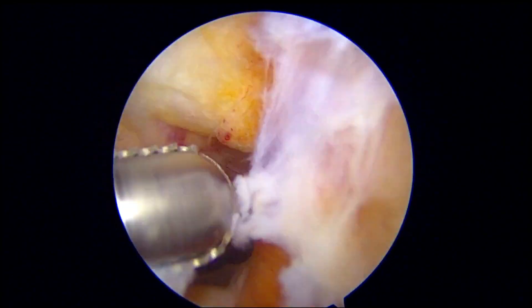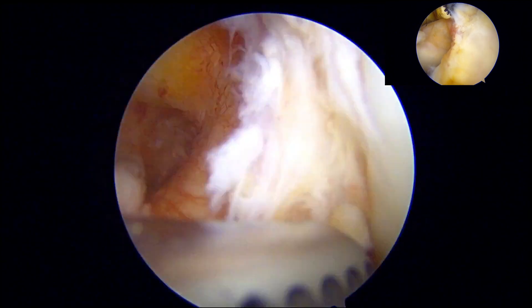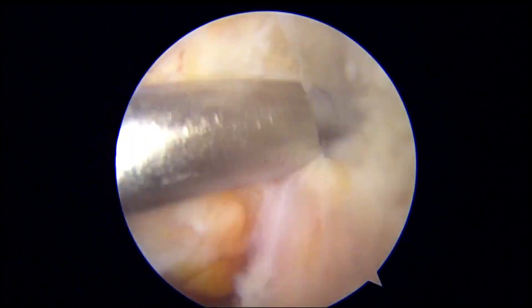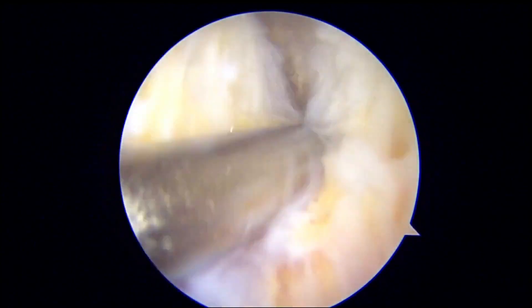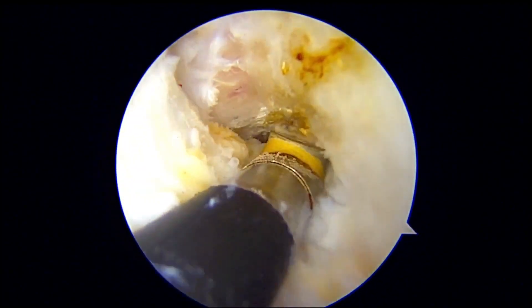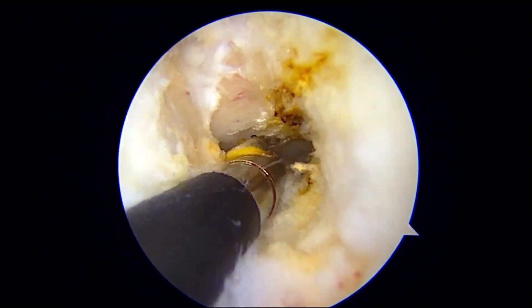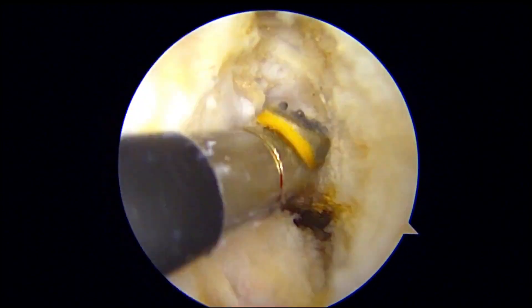The remnant PCL is visible. Buckling of the ACL is also observed, which returns to tension with an anterior drawer test, indicating a PCL rupture. In this PCL reconstruction, an intercruciate approach will be used to access the transseptal technique. Therefore, the anterolateral and anteromedial portals will be created as close as possible to the patellar tendon. After evaluating other intra-articular structures and clearing the excessive fat pad, RF was used to access the roof of the notch between the ACL and PCL — the 12 o'clock access.